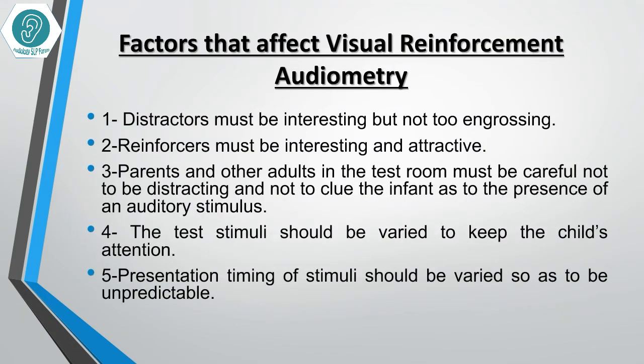Factors that affect Visual Reinforcement Audiometry: First, distractors must be interesting but not too distracting. Second, reinforcers must be interesting and attractive. Third, parents and other adults in the test room must be careful not to be distracting and not to cue the infant as to the presence of an auditory stimulus.